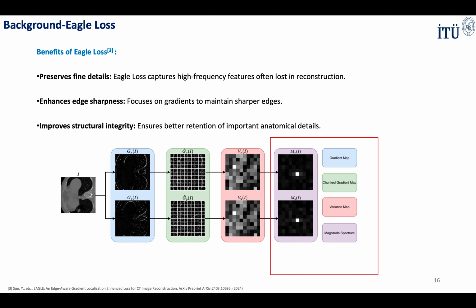After that, we use RSS to create an initial reconstruction from the corrected image. PromptUnit then steps in to enhance this image, making it clearer and more detailed. The K-space is repaired during this process, recovering lost details. Finally, we get the fully reconstructed image, much better than the initial undersampled version.